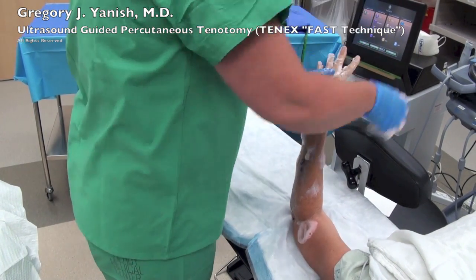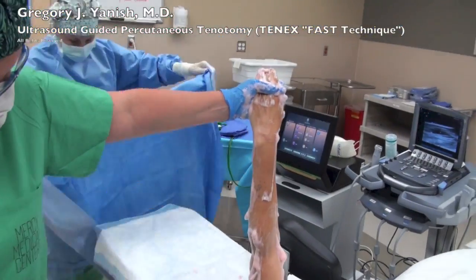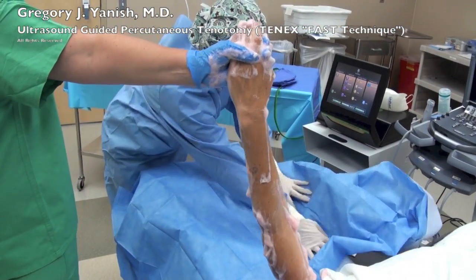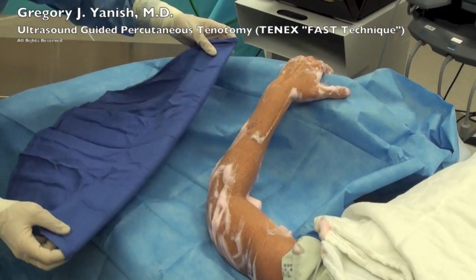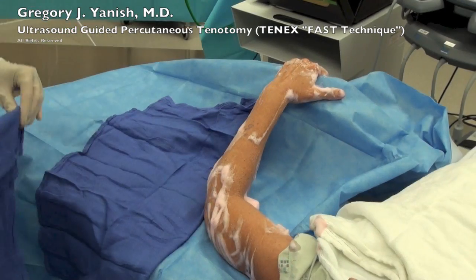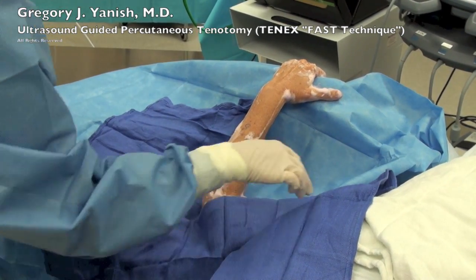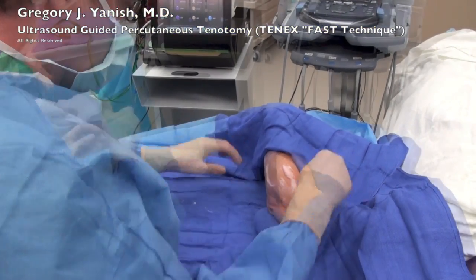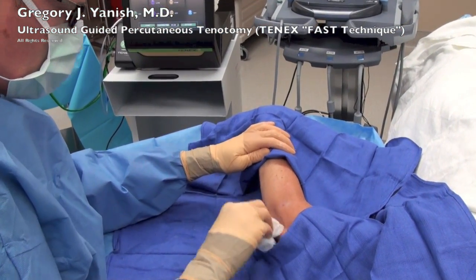The patient's arm is being prepped with chlorhexidine or Hibiclens, and the operating room nurse will set up a sterile field using sterile drapes and towels. Once the sterile field is in place, I will find my anatomical landmarks and begin the procedure.